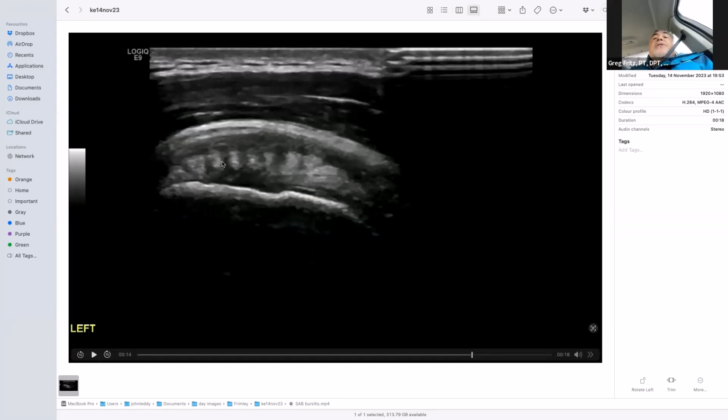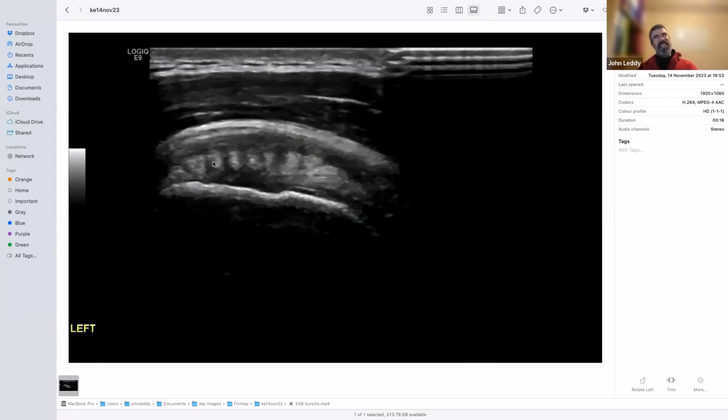What you're showing me here is a differentiation between supraspinatus below and infraspinatus on top? Yes, the supraspinatus fibers are going in one direction, and the infraspinatus is there. I know there have been various studies to show they interdigitate. I suspect if people ever go back to them and look at them in detail, that will be a somewhat localized effect, because you couldn't get large amounts of bundles going through there.